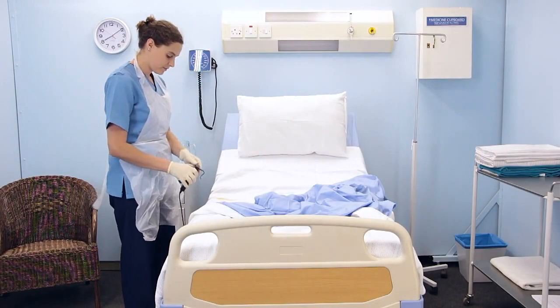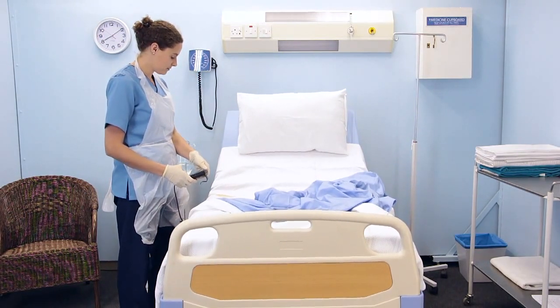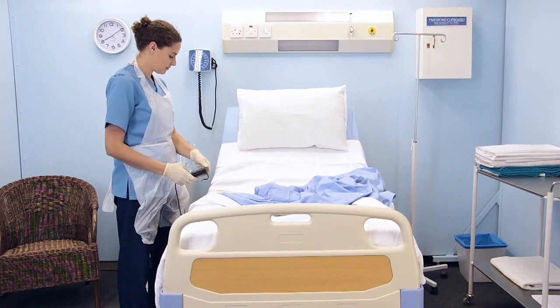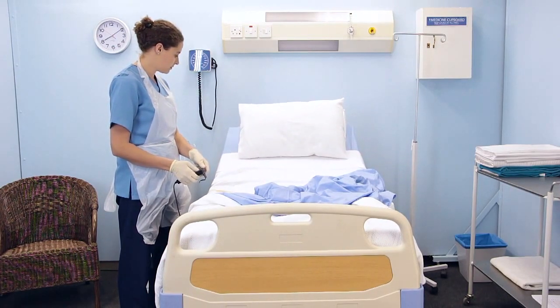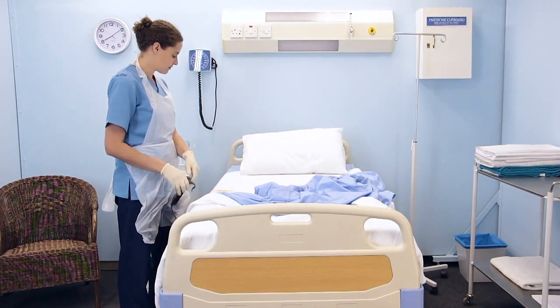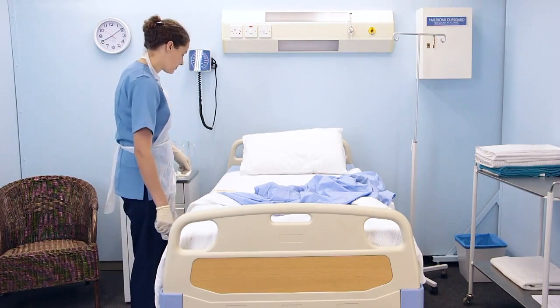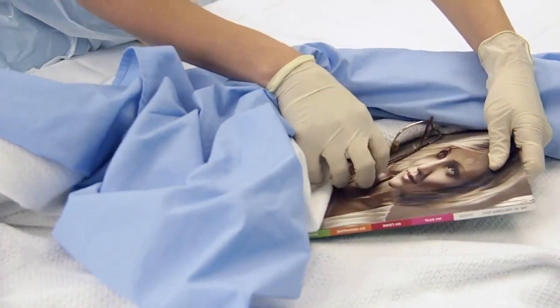Adjust the bed to a high position and lower the side rails if required. Place the bed in a flat position. Check the patient's bed for any of the patient's personal items that might have been hidden in the patient's bed.